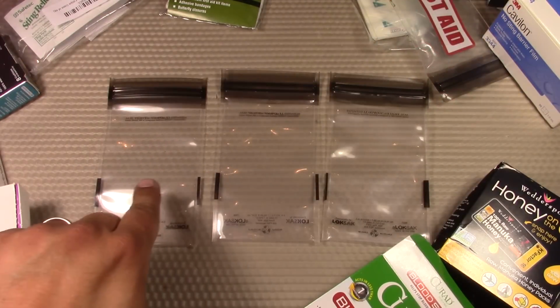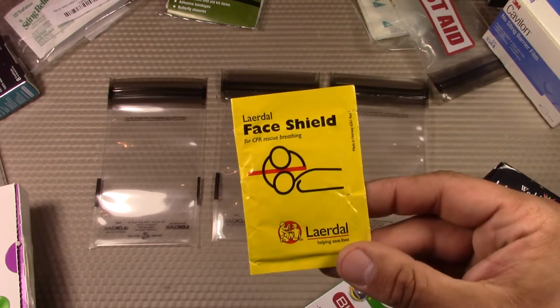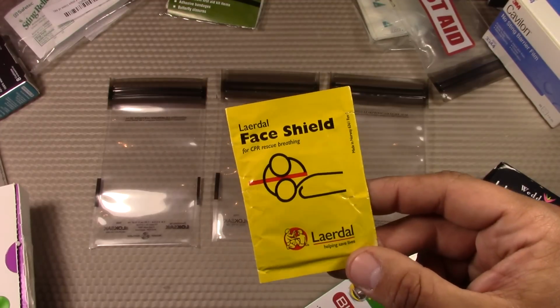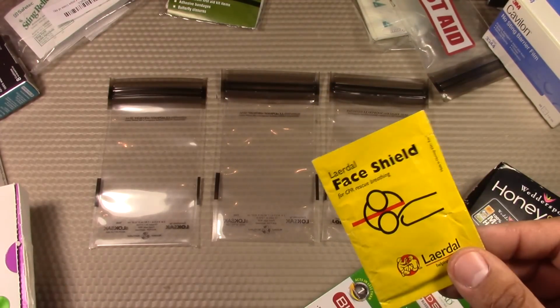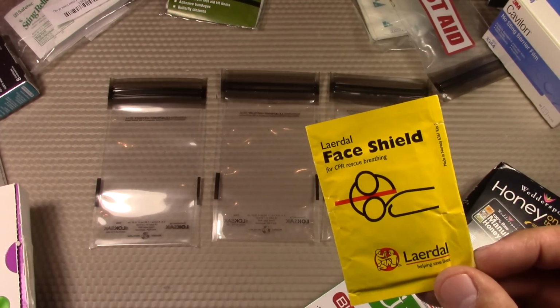Here are the 3 Locksack bags that we'll be using for these Mini Medi kits. I just realized that I forgot to pick up 3 additional CPR face shields. So let's just construct these without the face shields in there, and when we ship the giveaway contest winners, I'll make sure that I include those face shields in there.